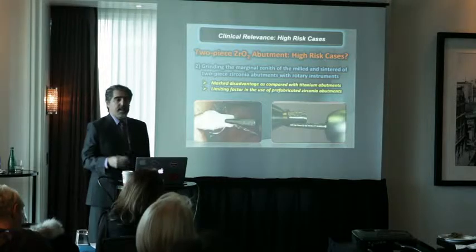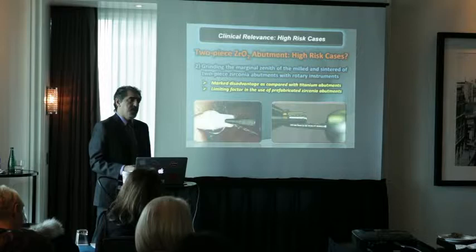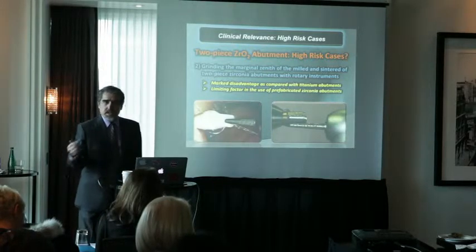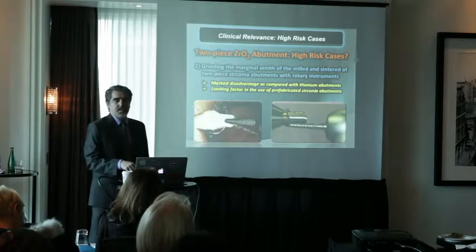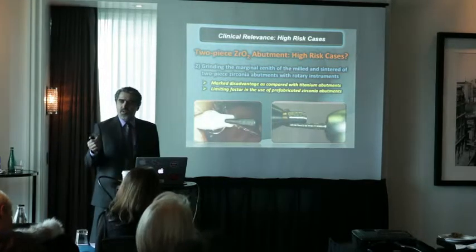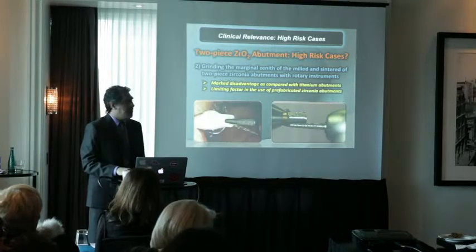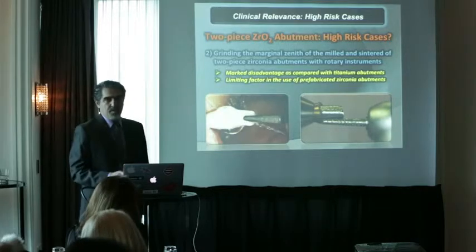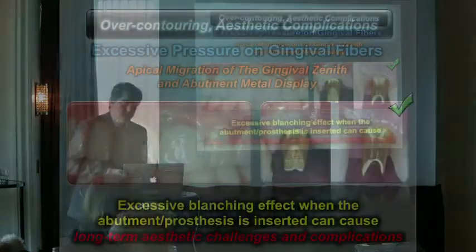There were cases that you have seen, or have had, those prefabricated zirconia abutments. The zirconia abutment was there, you would place it, you would start preparing those zirconia abutments. That was very cost effective, taking the impression at abutment level, and then you would have the crown on them. But it's a very, very risky way to restore that, and you're going to have a high risk of fracture.